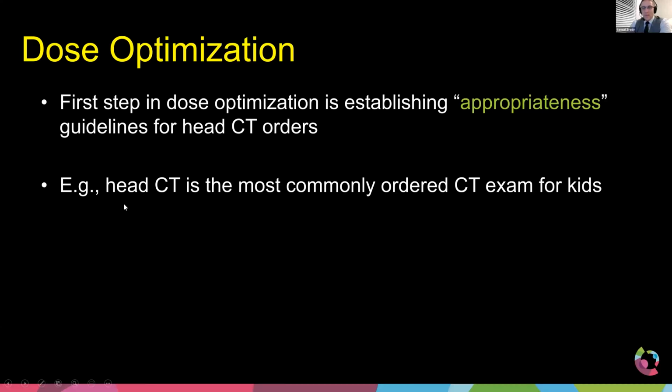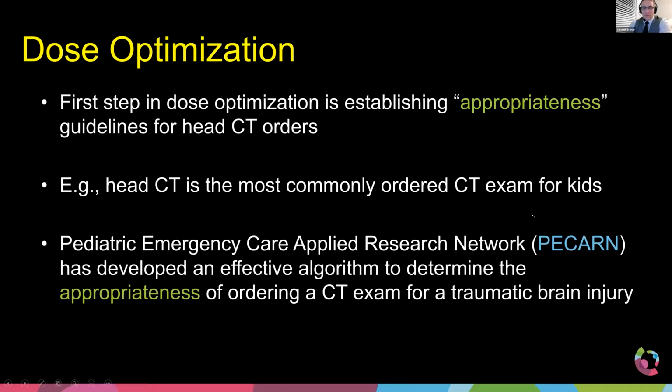And so I'm just going to give you this example. This is something that we do here in the US. I imagine you guys do this. You probably have something equivalent to this in Thailand. But head CTs are one of the most commonly ordered CT exams for the kids. I showed you that in those pie charts.